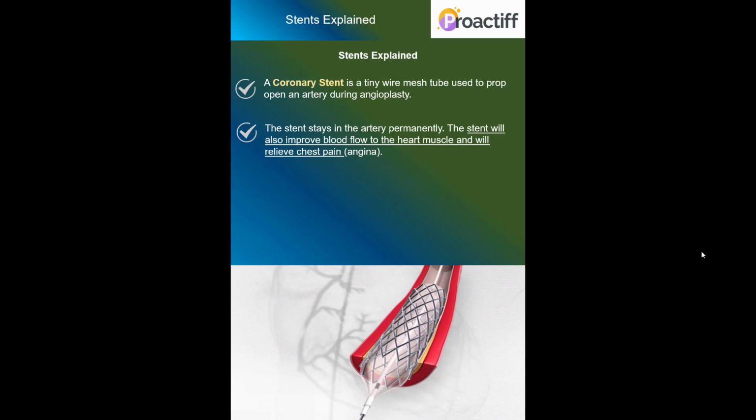The stent will also improve the blood flow, which is its core purpose for the deployment in the artery and the muscle, and will relieve the chest pain, which is referred to as angina.